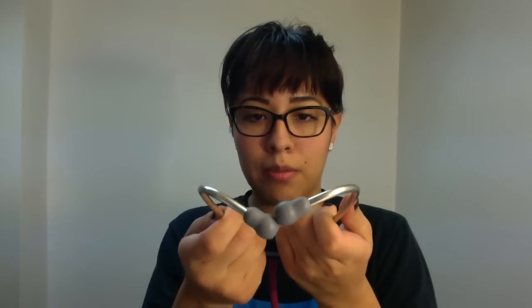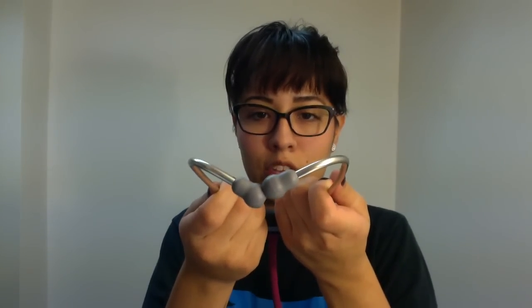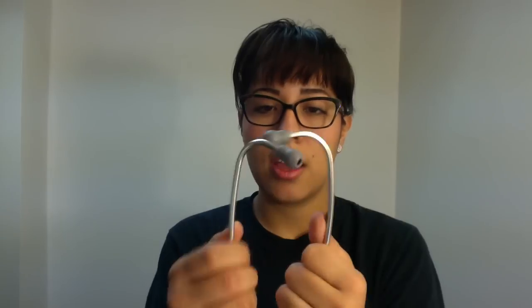Another way to guide yourself is by the direction that the ear pieces are facing. If you look at them side by side, you will see that they are pointing away from your face, and so that's a good way to remember as well. The ear pieces need to be facing away from your face.